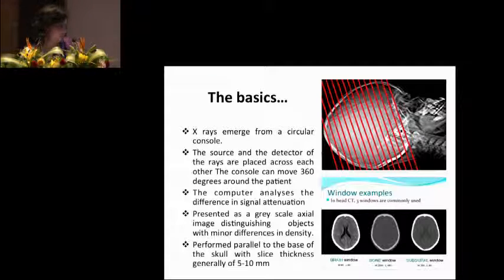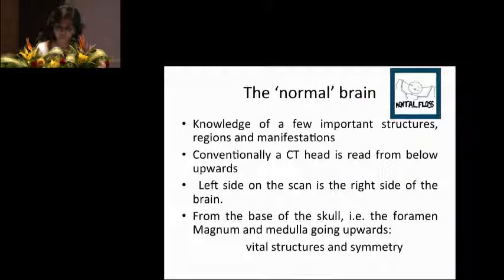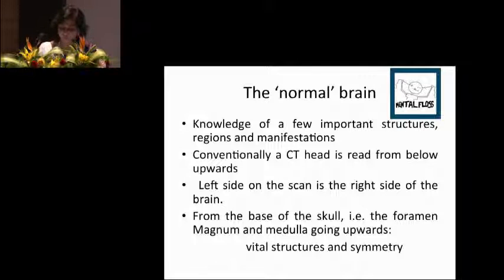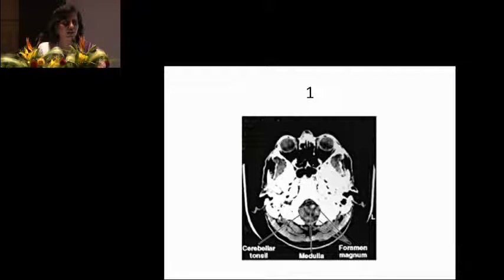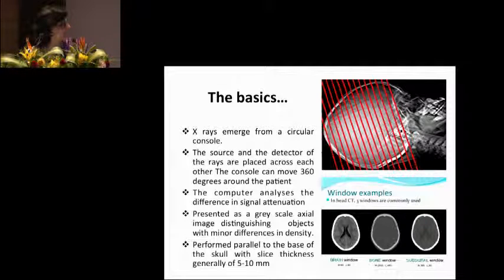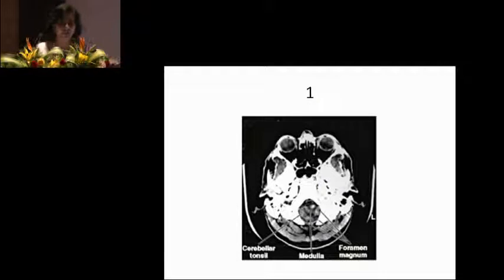We also have windows. If your radiologist wants to look at the brain properly, he'll call for the brain window, the bone window, or the subdural window. In a CT scan, we go from down upwards, so left is right and right is left. If we know what the normal structures are on our path, reading becomes so much easier. There are eight levels we should be able to recognize in a normal brain scan, and it always starts from below, with cuts going from the base of the brain upwards.